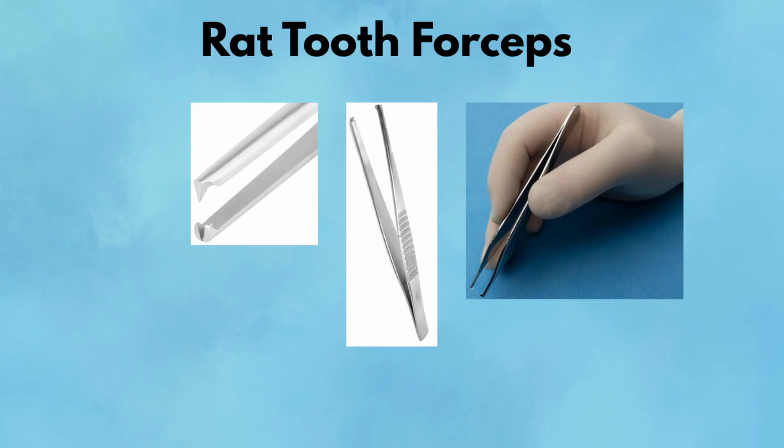Pearl: use these during fascia closure for efficient bite placement and to avoid slippage under tension. Pitfall: never use rat tooth forceps on bowel, vessels, or friable tissue — the teeth will puncture or tear delicate structures with ease.